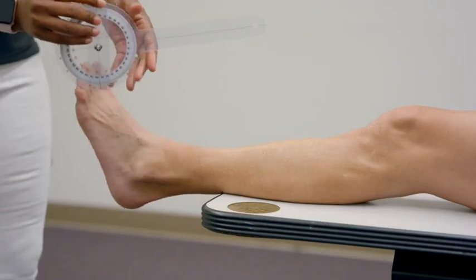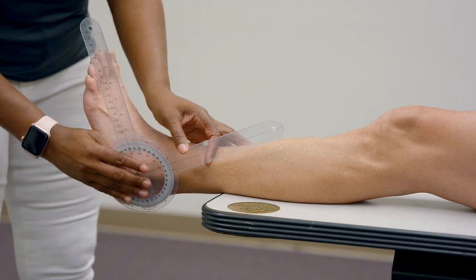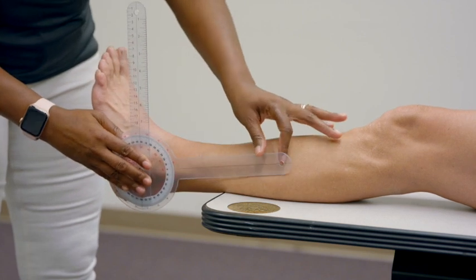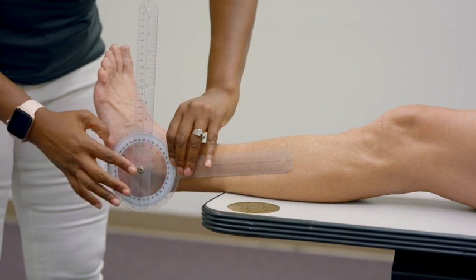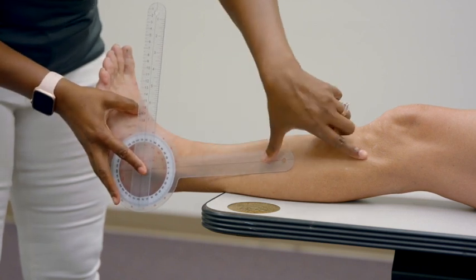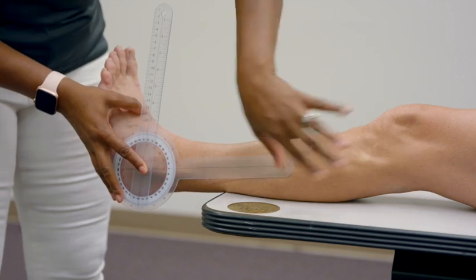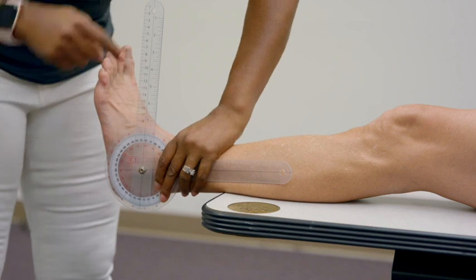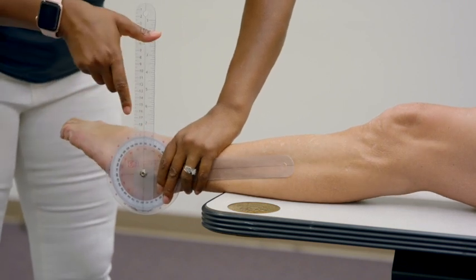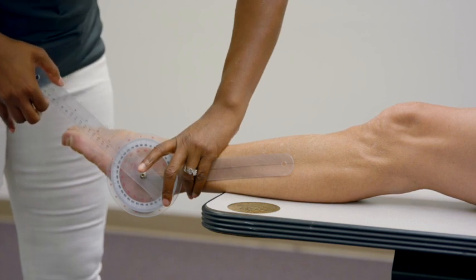Now we're moving into plantarflexion. The setup is the same as dorsiflexion — stationary arm here, with the metal piece right at the distal portion or tip of the fibula. Measure to make sure it's bisecting the fibular head, then stabilize and have your patient point their toes down as far as they can.